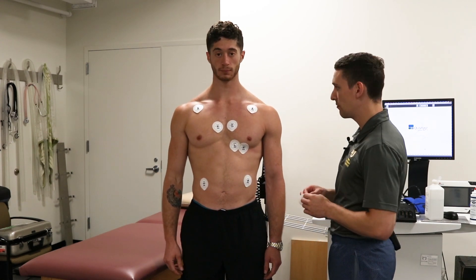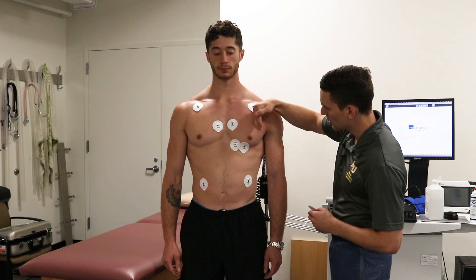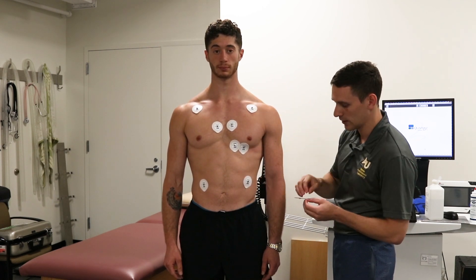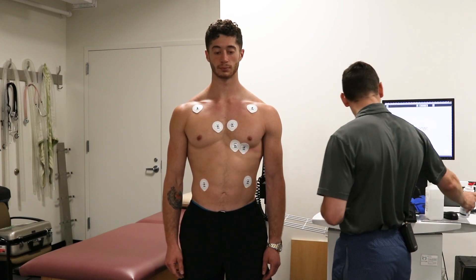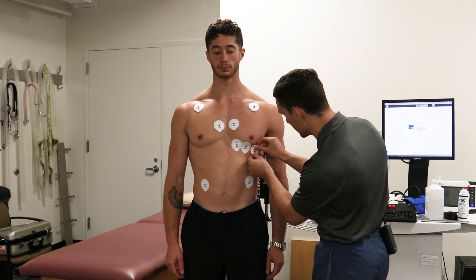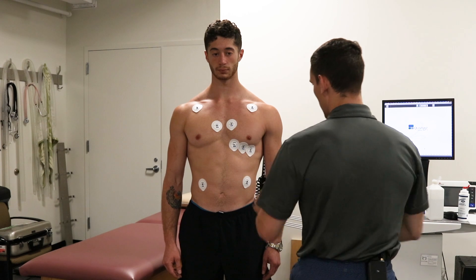Moving on to our V5 lead: V5 is on the anteroaxillary line, and you'll find that's directly in between your left arm and left leg leads. We follow that fifth intercostal space, placing the lead and double-checking it's directly in line.